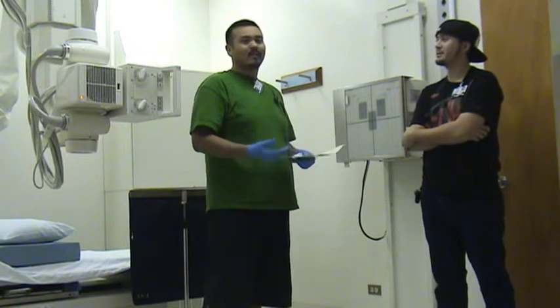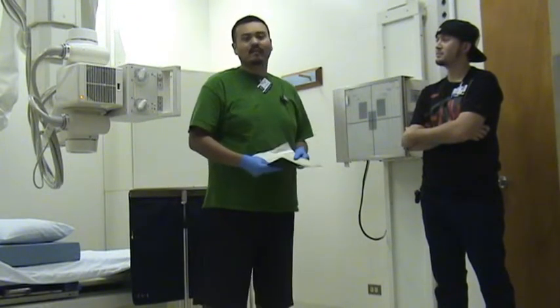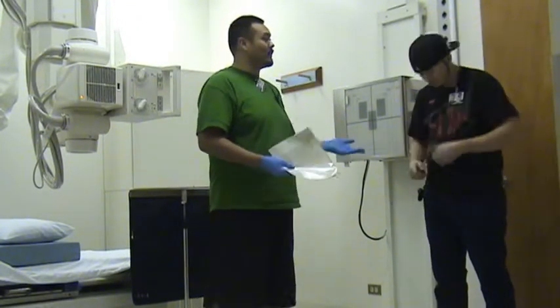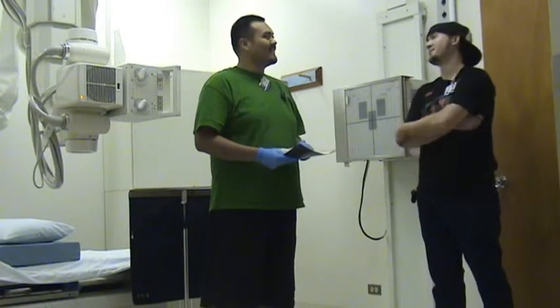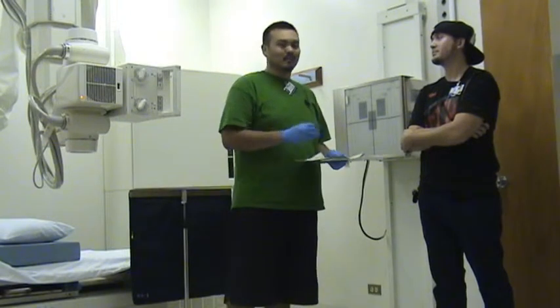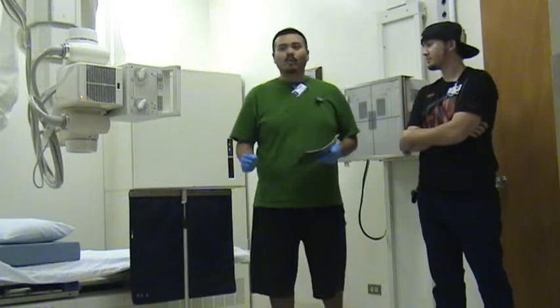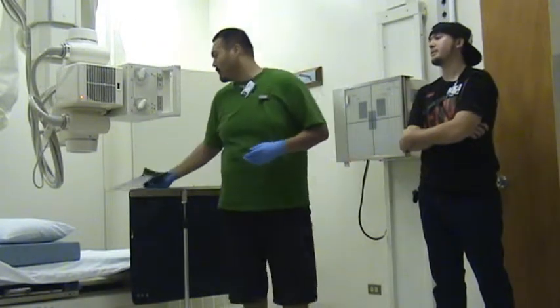Okay. It's always good to just ask these little questions. If my patient here was a female, of course you would want to ask if there's any chance of pregnancy. Would there be any chance of pregnancy? No. No chance of pregnancy? No. All right, that's always good. So just make sure you ask, just to double check. You want to make sure you have your shield ready to go. You always want to make sure you shield your patients properly.